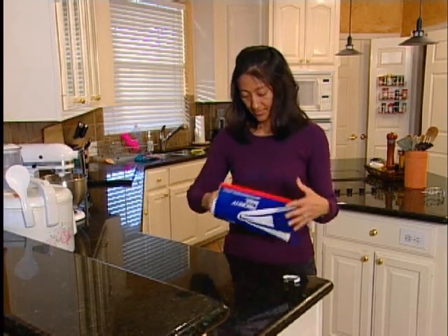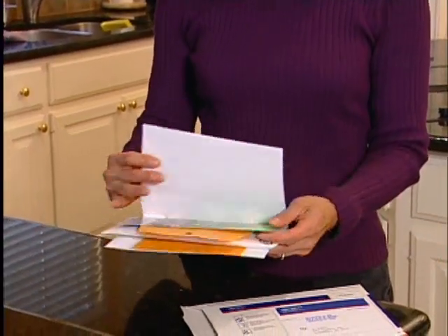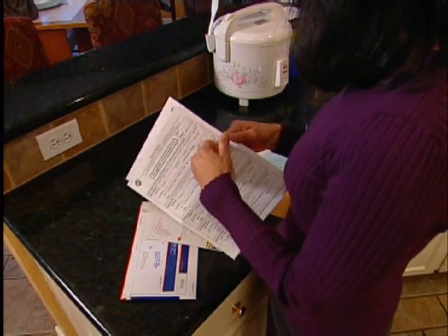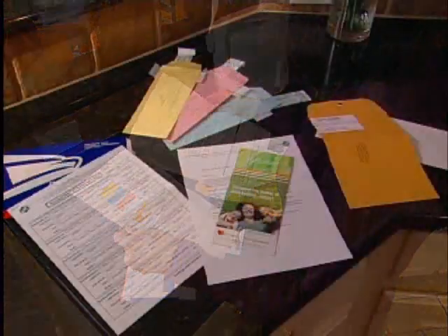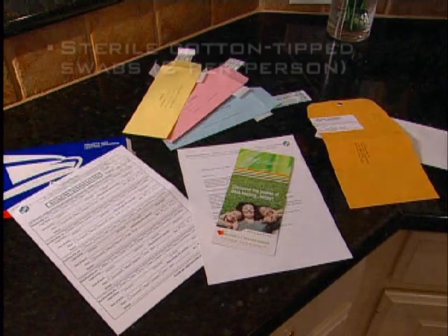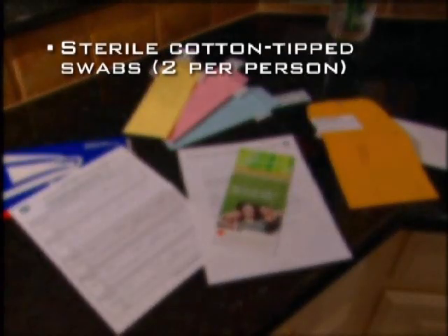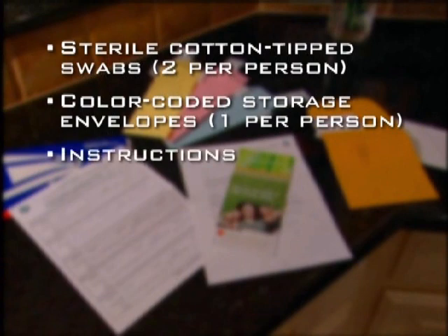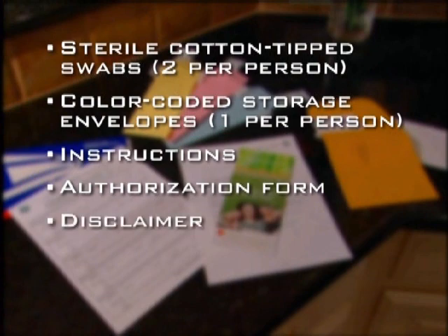The collection kit will be mailed to you for at-home DNA collection. This kit is used to collect buccal swab samples from each person that is to be tested. The materials you will find in your kit are sterile cotton tip swabs (two per person), color-coded storage envelopes (one per person), instructions, authorization form, disclaimer, case number card, and a return envelope.